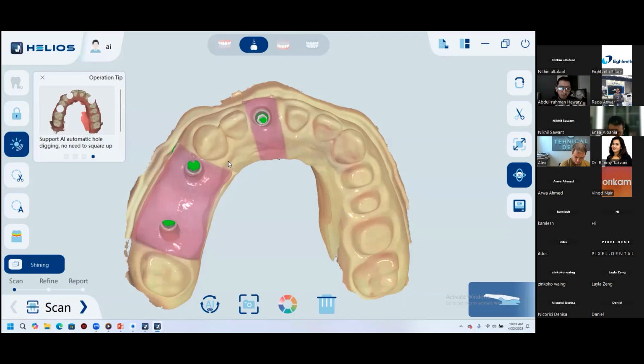These are tips and tricks that are discussed in full arch cases, and it's actually a very huge lecture, and it's very informative. It has too many details, too many examples and too many clinical scenarios. So it depends mostly on the case. Whenever someone has a case like this and wants us to give some insights, please just share with us any photos of the case, any scanning videos or scanning files.